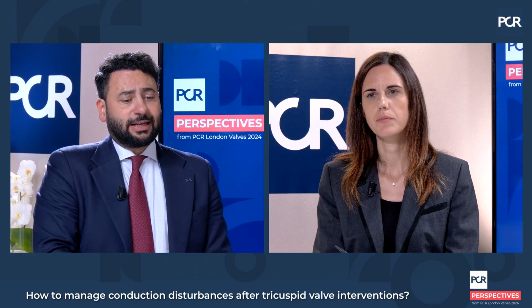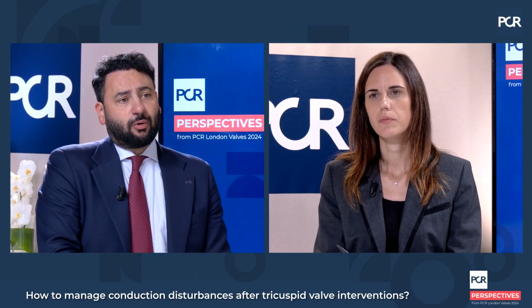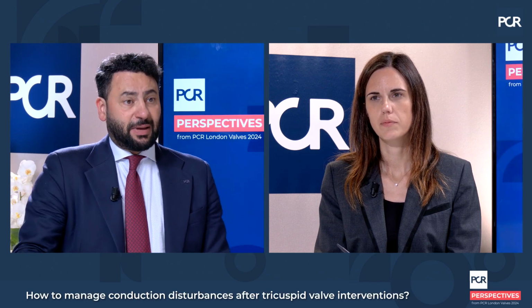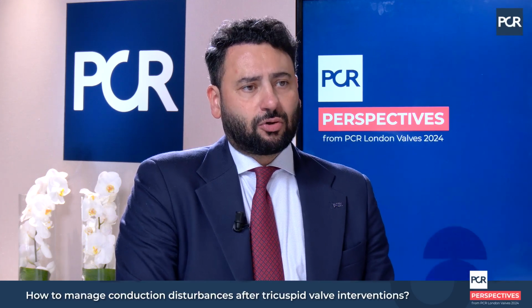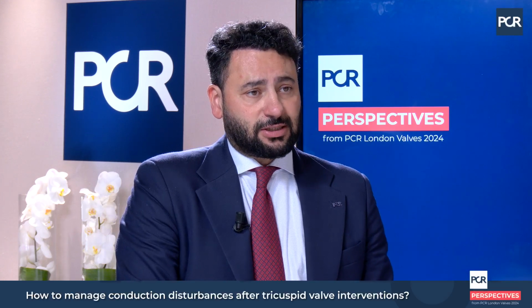In case it happens, as is common, in the first week, we have to set a strategy for valve-sparing pacing options. In most cases it has been done through the coronary sinus to a lateral vein in the ventricle, or even with a leadless pacemaker. I think those are the two main recommendations for this kind of complication. Thank you very much, Roy.